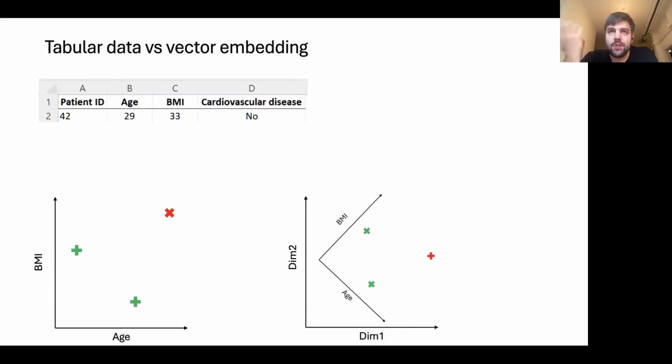For instance, image quality: for a lot of tasks that we want to do with retinal images, we would like a model that's invariant to whether the image is slightly higher or slightly worse quality. We want to know what's actually going on with the retina. But of course, if we had a model that automatically told us whether it is a good or bad quality image, we want that information. So what information you want your vector to capture depends on the downstream task.